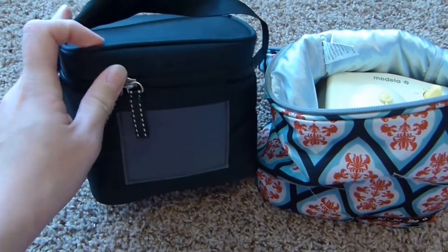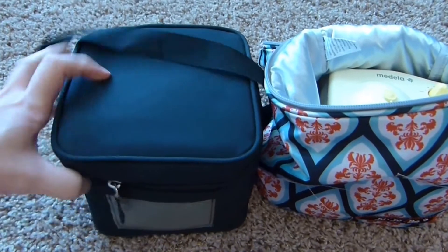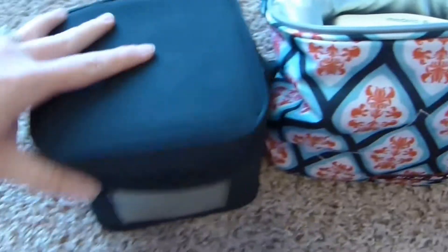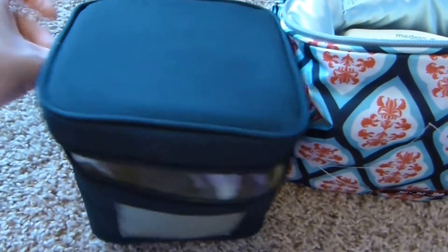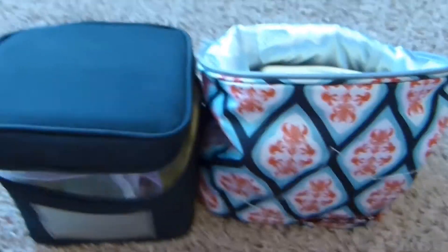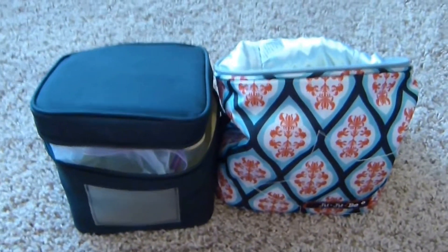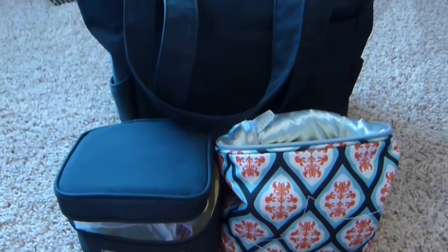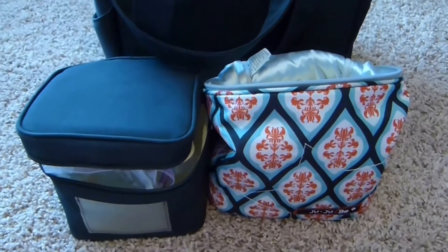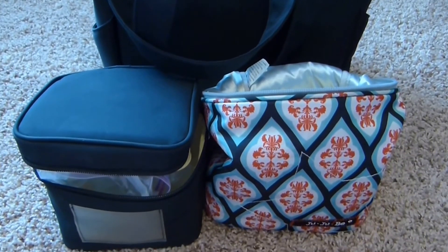I still use the little bag that came with the Medela pump to store my milk and the actual flanges, since all of that is refrigerated it has to be separate anyway. But this is a much smaller setup than using that giant bag, which helps because I already have to carry enough stuff into work. I hope you enjoyed my video — thanks!